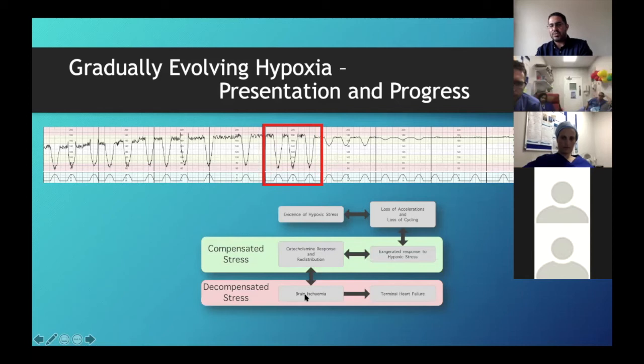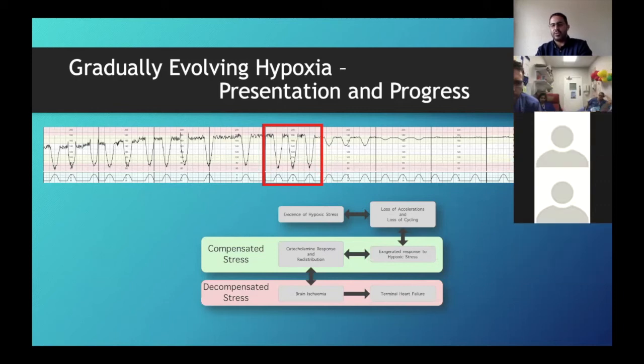So yes, we said that some brain ischemia can recover, but why would we do that? Why would we go all the way into blacking out and then hope to recover? It gives us very little time, and it's a very stressful time. The reality is we are trying to prevent the baby progressing along the redistribution path as much as we can. But if STAN starts alarming, this is becoming urgent, because the ischemia or the redistribution is reaching the level of the brain and heart. Does that make sense?